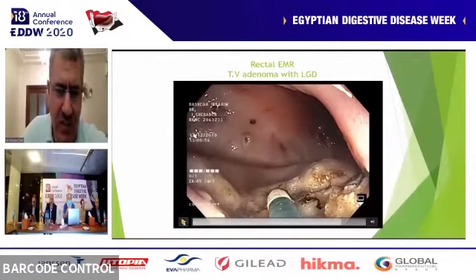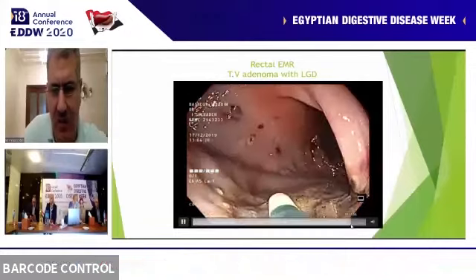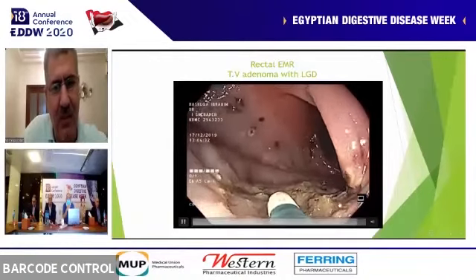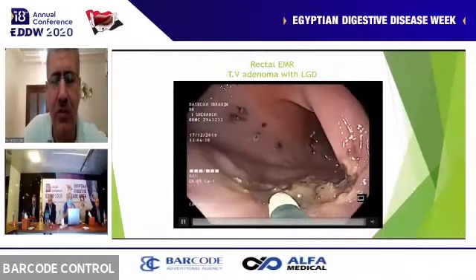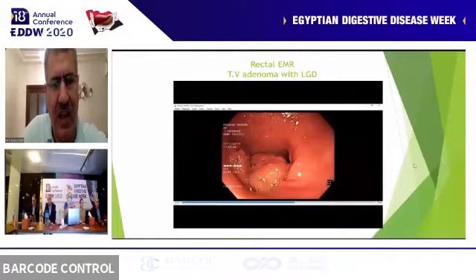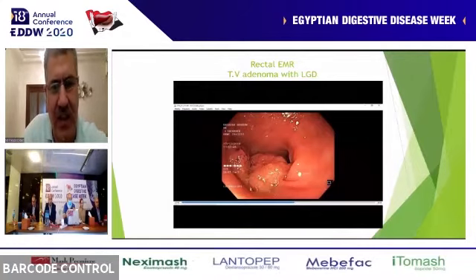But once you're done with taking all the gross tissue and you make sure that there's nothing remaining, it's very reasonable then to basically, with argon plasma coagulation, burn the base of the polyp if there's any submucosa left, and the edges. And this is for microscopic remnant and not for gross remnant. There should be no gross adenomatous tissue left in the lesion before you do this. And my policy is, I remove all the big polyp in one piece or in pieces, but I put them in one bottle, and then the biopsy goes into another bottle, because that's the tissue that's remaining around the edges. And that will tell you whether the edge is clear or not.